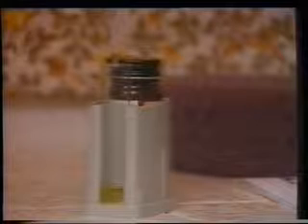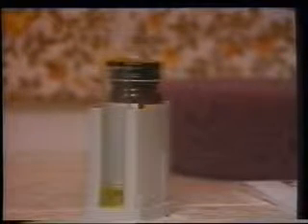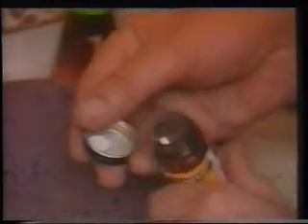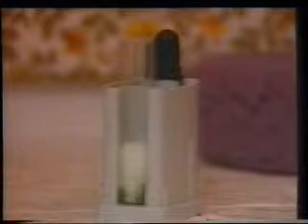Note how he holds the dropper vertically and keeps it away from the sides so that the drops go straight to the bottom. He then takes out a Clinitest tablet by removing the lid and shakes out a single tablet. The tablet should never be handled, and so John, using the cap, transfers the tablet from the bottle to the tube. Always replace the cap as quickly as possible to stop air entering the bottle.